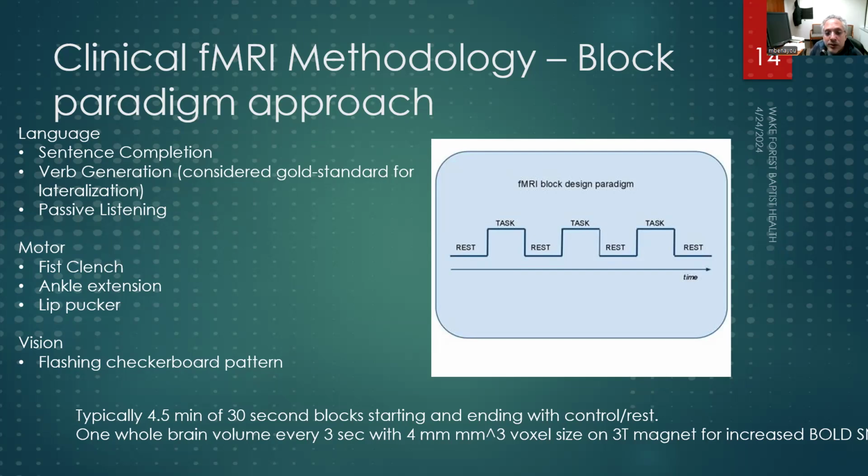But nonetheless, we should say that when you talk about fMRI, the best spatial resolution you get is in the range of millimeters. So, think about that relative to the spatial resolution of most electrophysiology, even network level electrophysiology. Probably better than surface EEG. I think surface EEG takes a much larger chunk of tissue to get a signal, but probably not as good as subdural implanted electrodes.